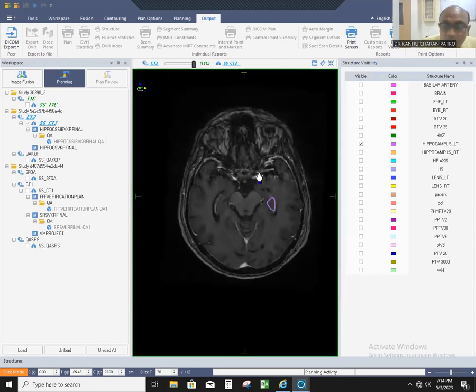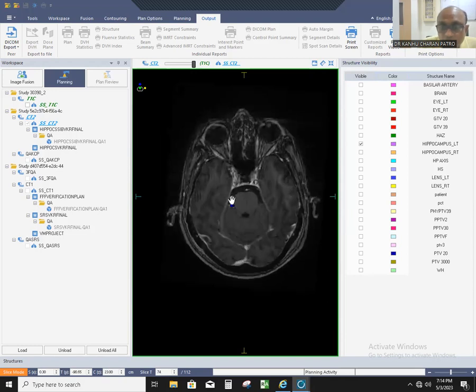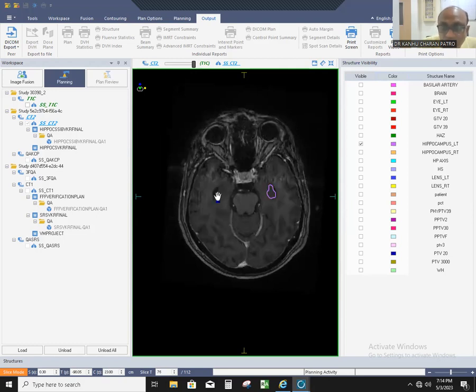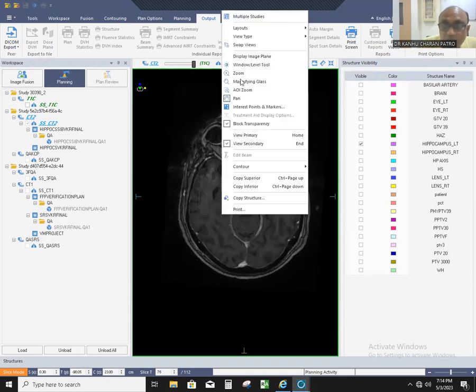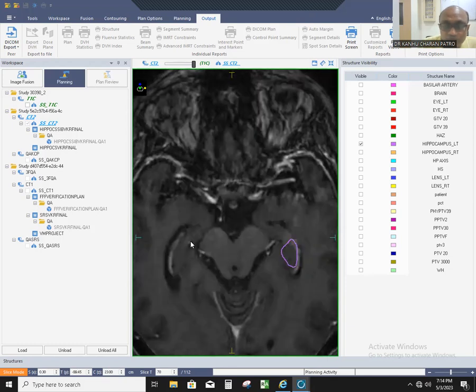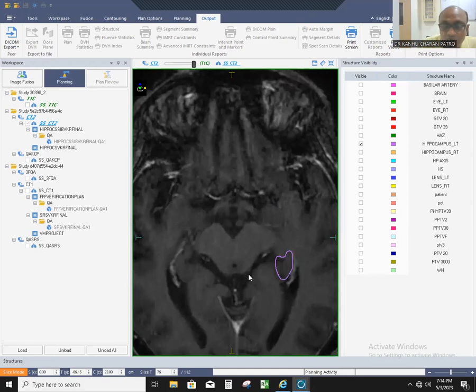I will show you the right hippocampus contouring. This is called the temporal horn of the lateral ventricle. Posterior medially there is a hypointense area — you can see it here. This superomedial part should not be contoured. Here we contour the left side. Going up, you can see this hypointense area to be contoured. Continuing upward, this is the quadrigeminal cistern. This is the hypointense area you have to contour.